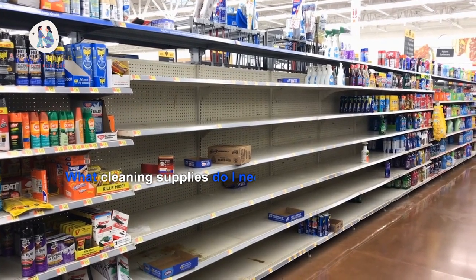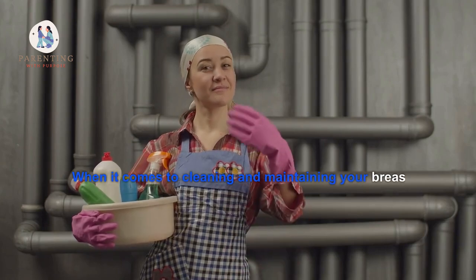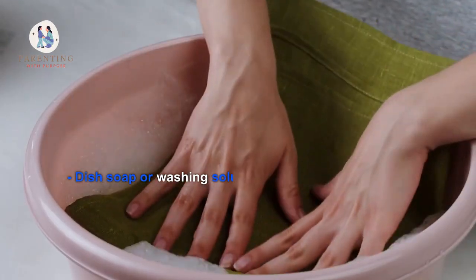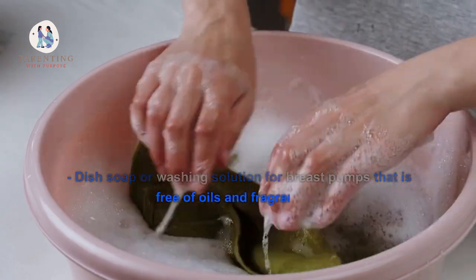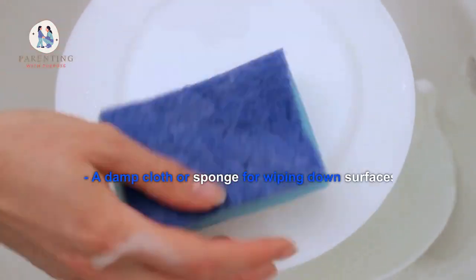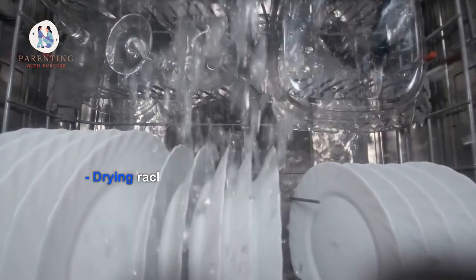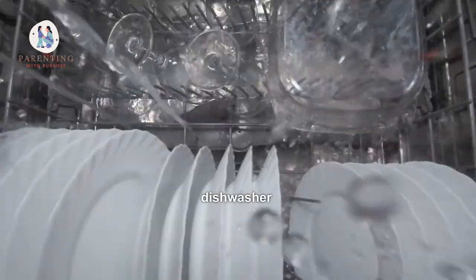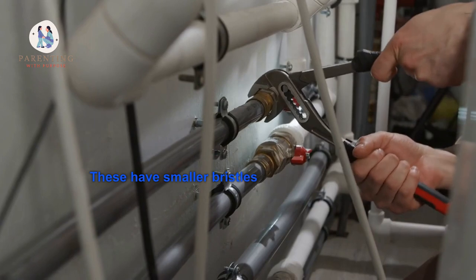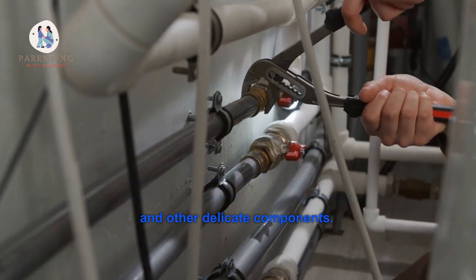4. What cleaning supplies do I need for proper sanitation of my breast pump? When it comes to cleaning and maintaining your breast pump, the most important supplies you'll need include: dish soap or washing solution for breast pumps that is free of oils and fragrances; hot water; a damp cloth or sponge for wiping down surfaces; disposable wipes for quick cleanings on the go; a drying rack for parts that cannot be placed in the dishwasher; and cleaning brushes specifically made for breast pump parts. These have smaller bristles than regular cleaning brushes, which help prevent damage to tubing, valves, and other delicate components.